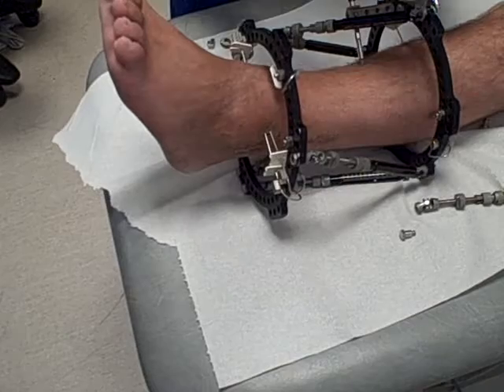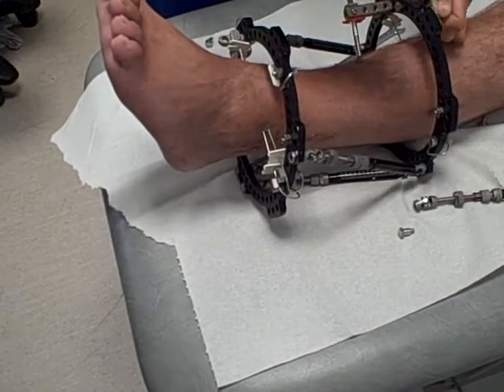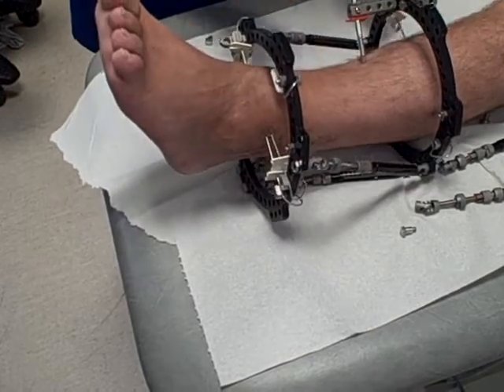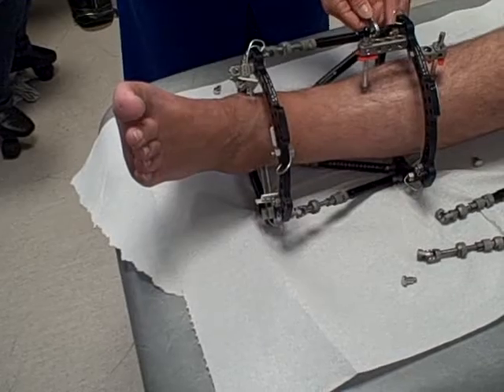It's a bit fiddly, but it's OK, not too painful. So you're literally going to be left with the top ring and the bottom ring and the pins and wires just going through, so there'll be no struts on at all.